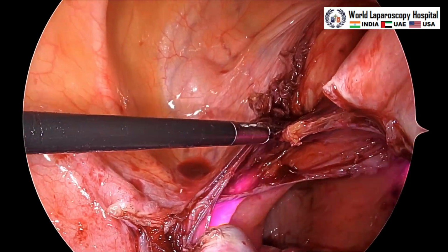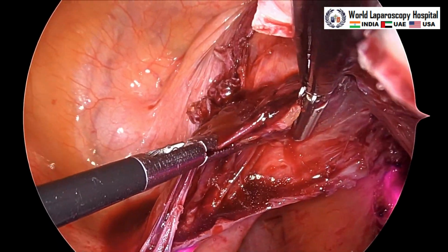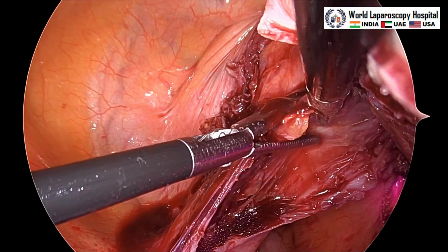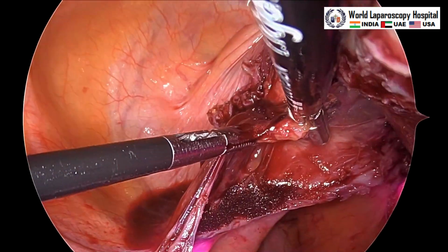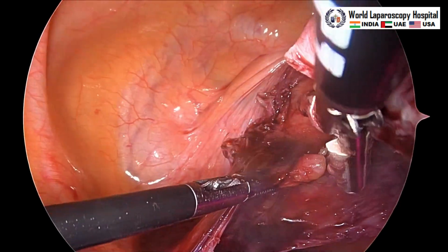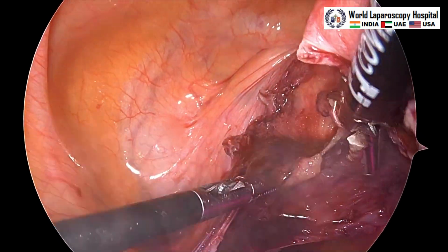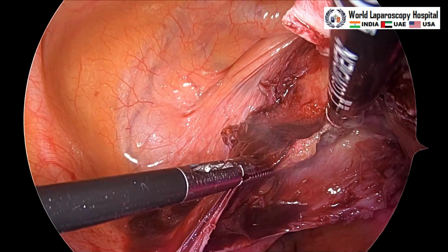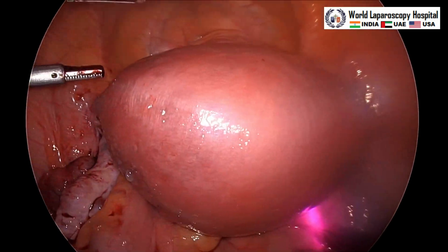Now the uterus is again at 3 o'clock position, and we will coagulate the uterine artery of the left side, but this will be only coagulated. What is our strategy generally? That the first time we don't cut, we coagulate and leave it, and then we go to the right side, again coagulate, and we cut later in the second time. So that has the advantage that proximal thrombus also will form, and proper hemostasis can be achieved.